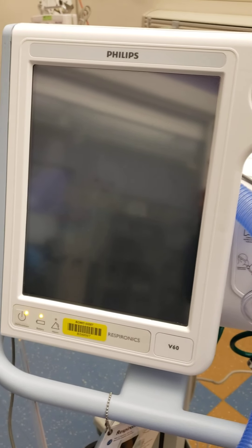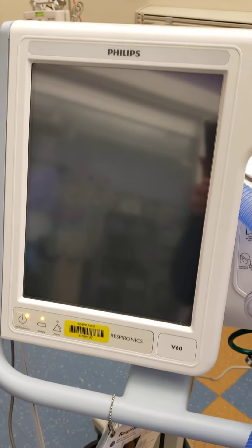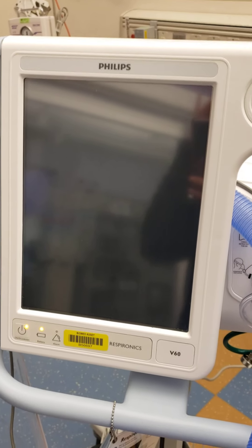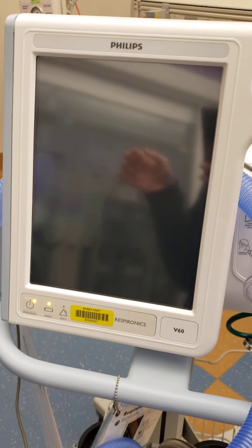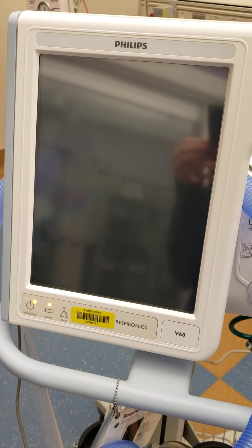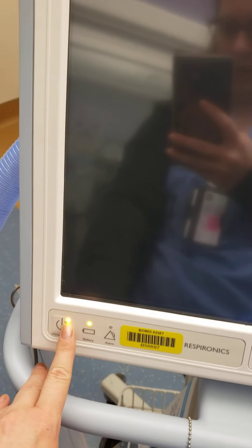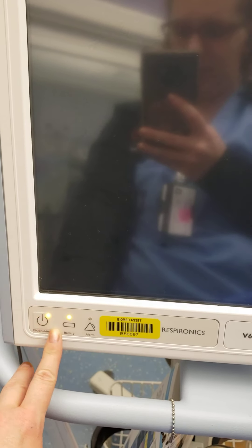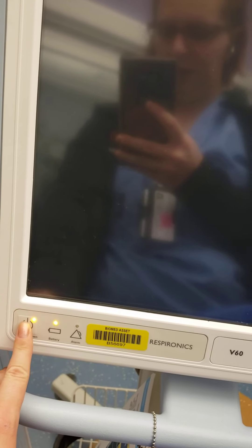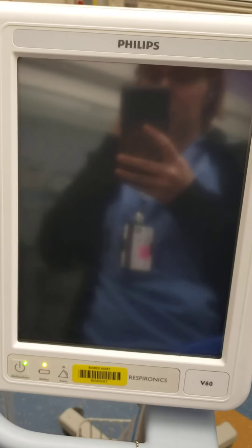Welcome to part two of Respiratory 2140-2160, equipment for BiPAP. I just changed our view so you can actually see the screen of the Philips Respironics V60. Down here you can see yellow means we're on standby, but we're plugged in ready to go. We can see our battery status and alarms here, so we're going to turn it on with the power button.